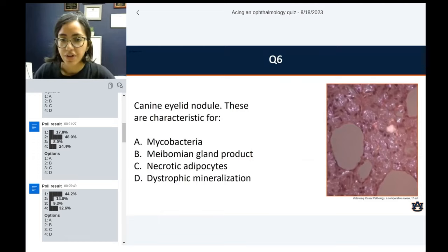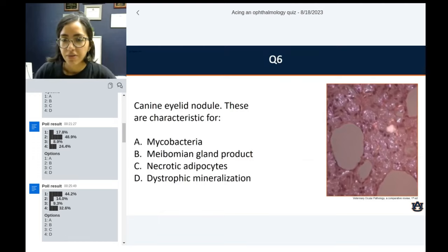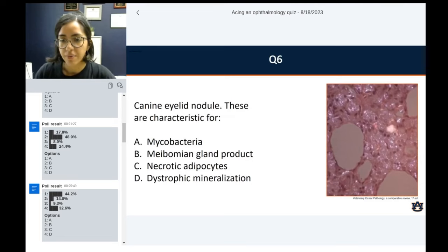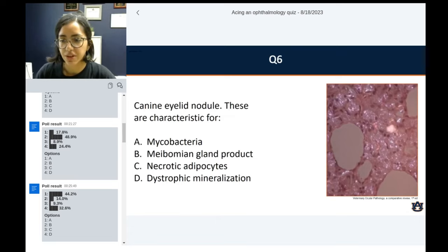Question number six: canine eyelid nodule. These are characteristic for: A, mycobacteria; B, meibomian gland product; C, necrotic adipocytes; or D, dystrophic mineralization.